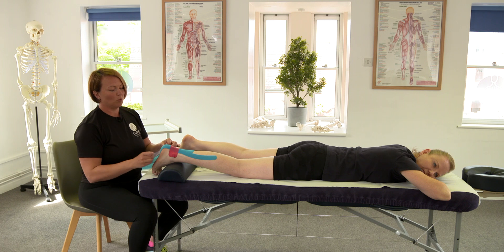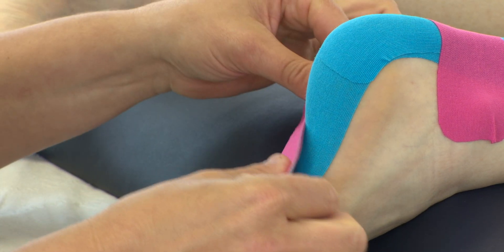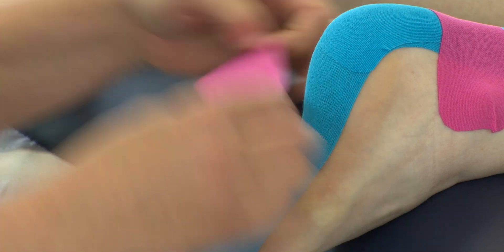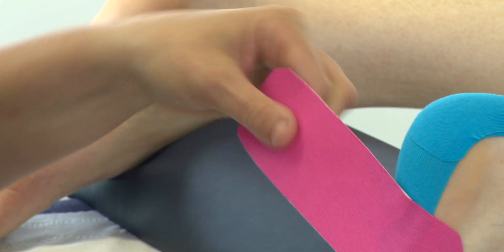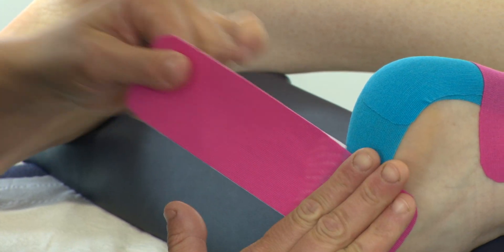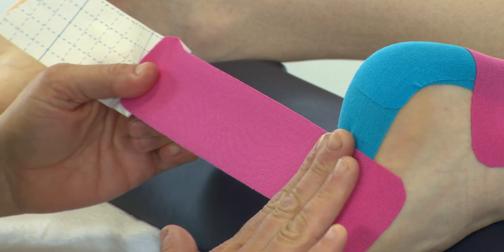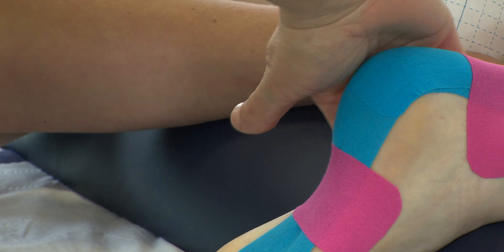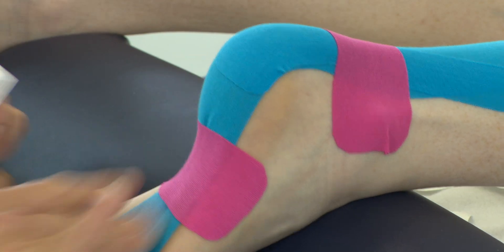We can also support the arch. When we have plantar fasciitis the plantar fascia can be quite sore. We can support the arch by adding a strip that goes through the bottom of the foot around to the top of the foot. Foot's still on stretch. On the lateral part of the foot you're going to apply the anchor — remember no stretch — and this time we're going to have 75 to 100% stretch coming through the bottom of the foot to increase that support, coming up the medial part of the foot over the ankle, making sure it comes through that arch.